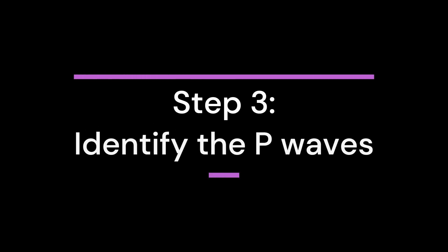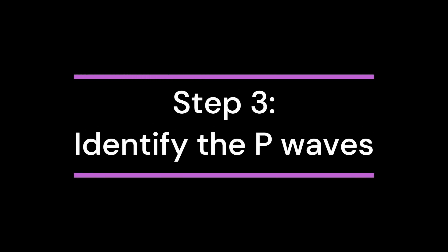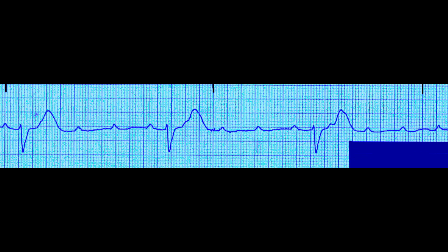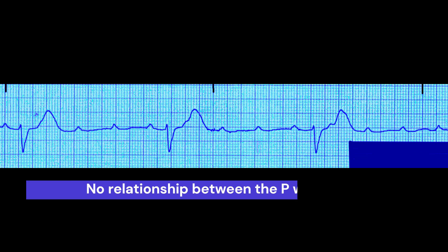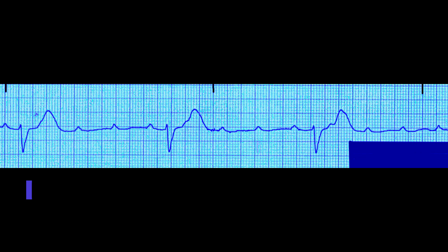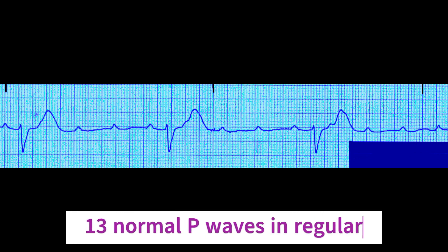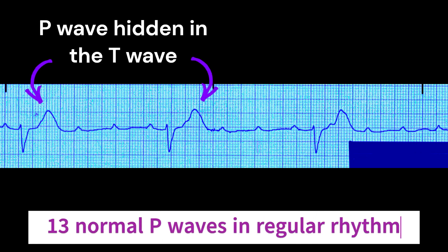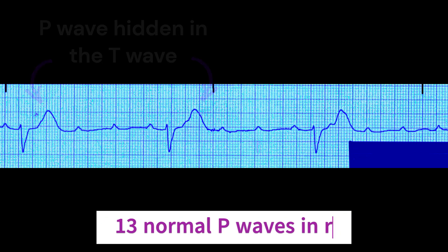Step 3: Identify the P-waves. In third-degree heart block, the P-waves will have no relation to the QRS complexes; therefore, the P-waves will appear at a different rate than the QRS complexes. In most cases, there will be more P-waves than QRS complexes. In this example, there are 13 P-waves in a regular rhythm that all appear normal in morphology, except for two P-waves hidden in a T-wave.